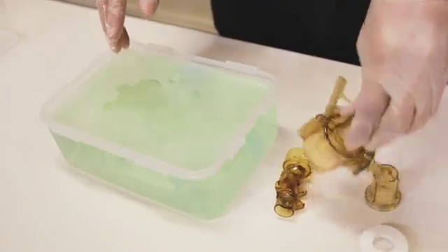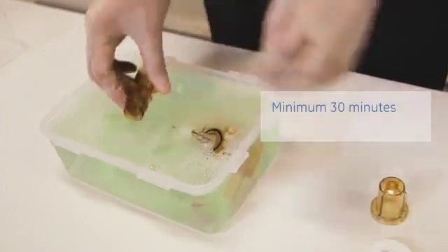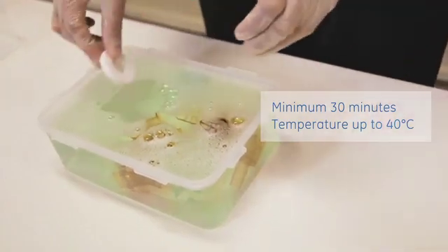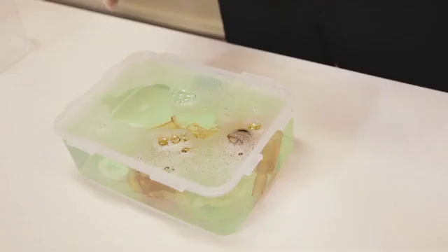Second, wash and soak the parts in the mild detergent solution for a minimum of 30 minutes in a clean soaking tray at a temperature up to 40 degrees. Ensure that all surfaces of the parts are submerged and no air bubbles are visible.